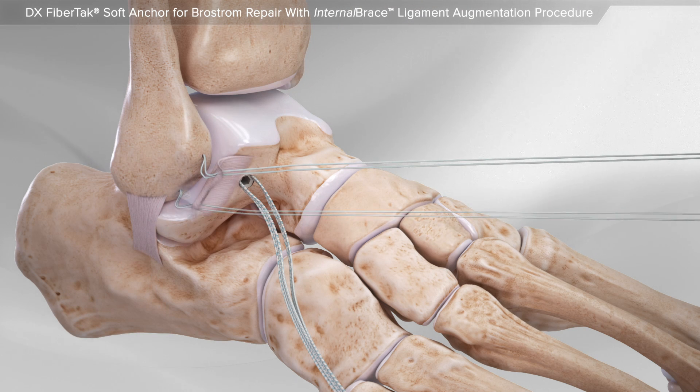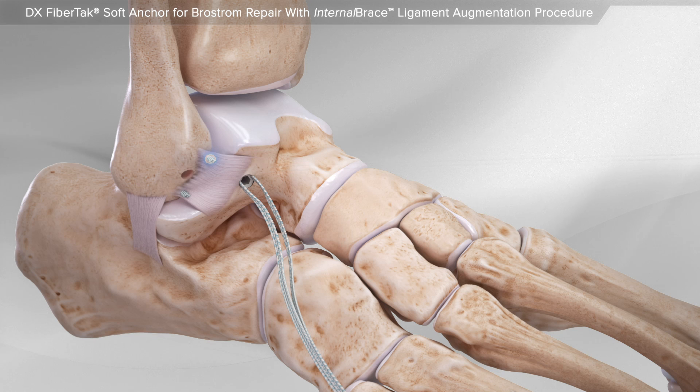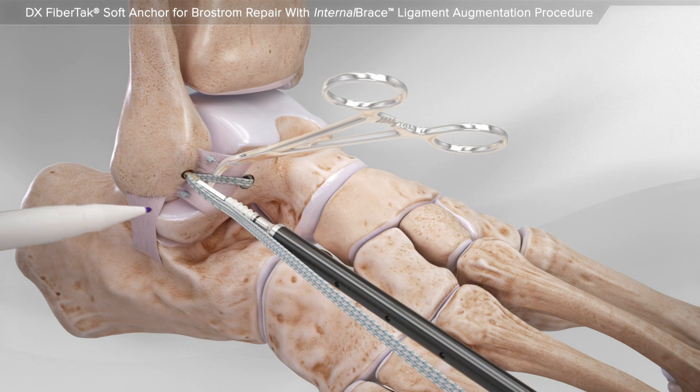Next, the sutures are placed through the torn ligament and tied to repair the tear. Then an additional hole is created in the bone and an anchor loaded with the high-strength suture is inserted.